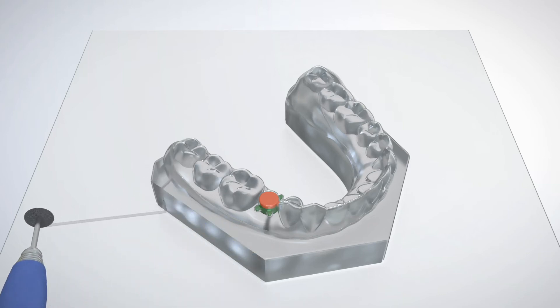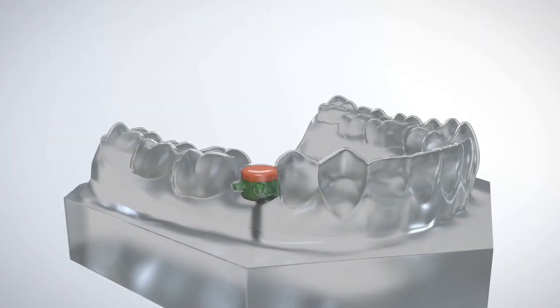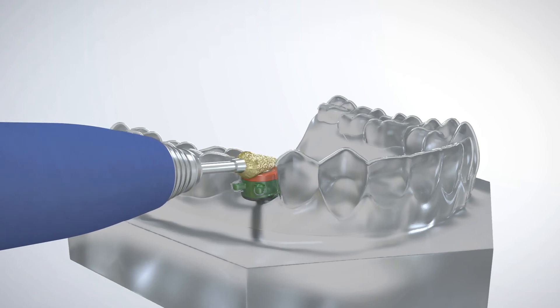The plastic covering the GRS protection cap is removed with a trimming burr, polishing wheel, or separating disc.